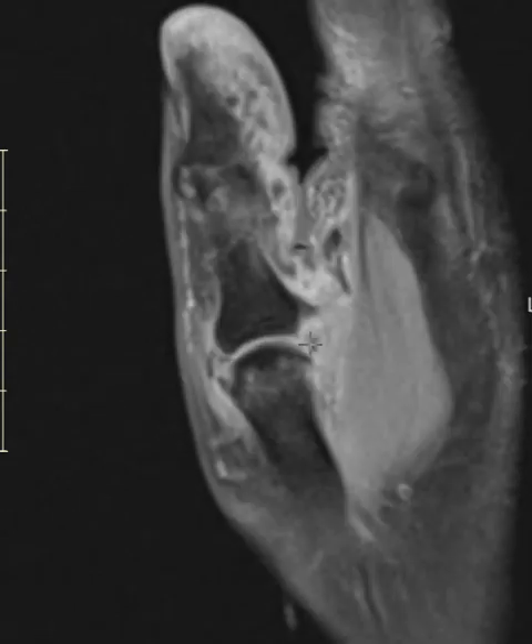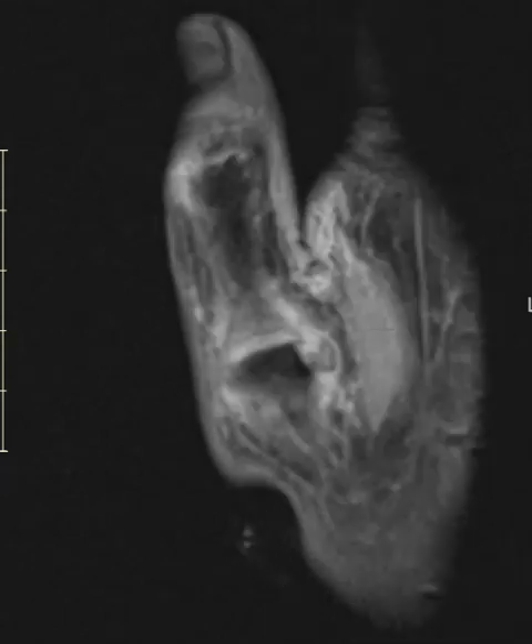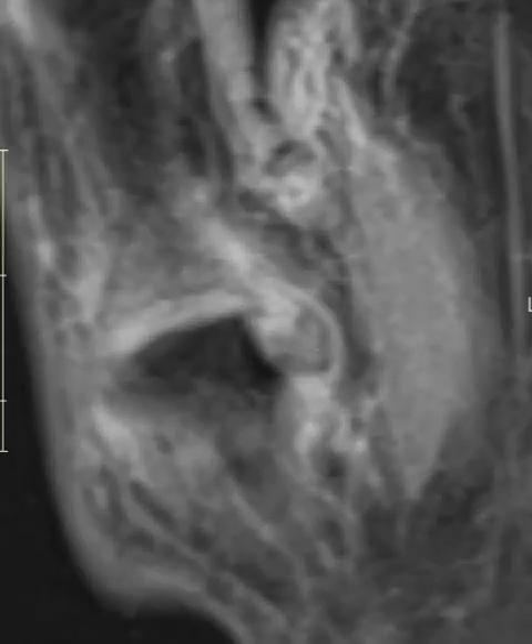Instead, the ulnar collateral ligament is completely torn. We don't see it here, but if we go to this view, we see the UCL that's retracted proximally. Instead of being longitudinal and straight, it's balled upon itself, kind of folded upon itself — makes a little U here.